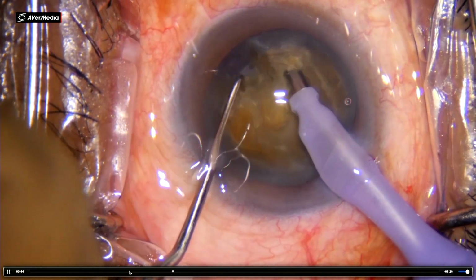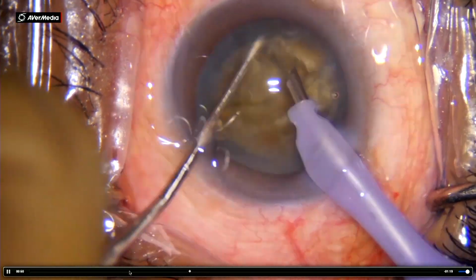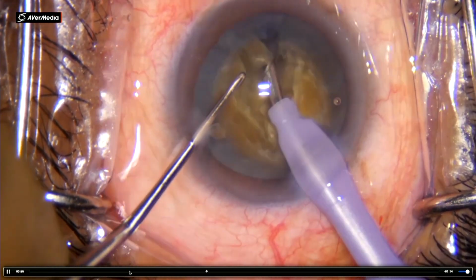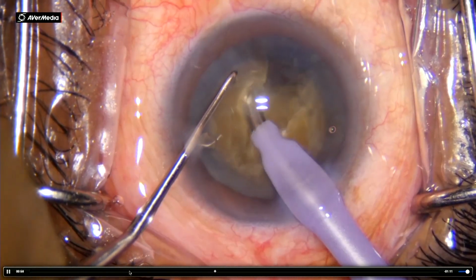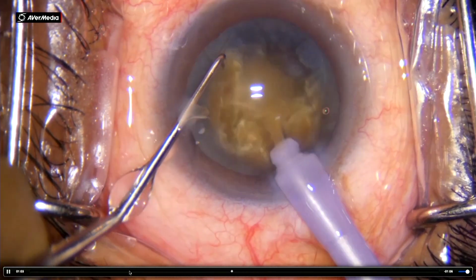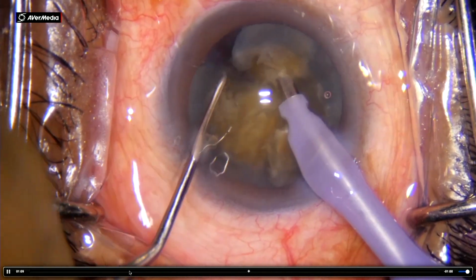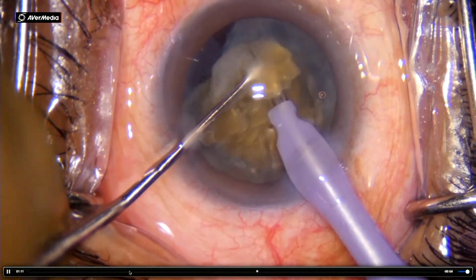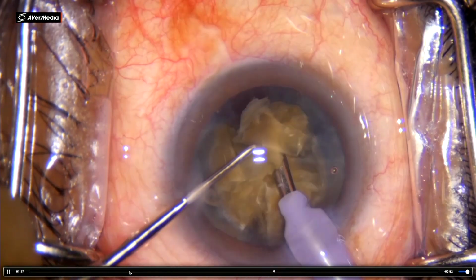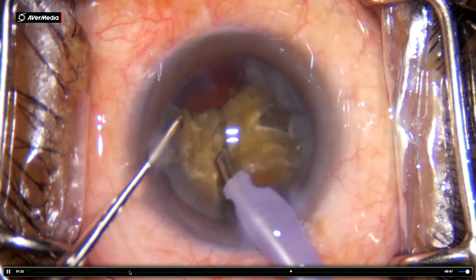So here is the stage when I'm holding the nucleus and splitting the nucleus into pieces. It's in a speeded up version, so it's not done this fast. It's in double speed, just to save time. So once the pieces are separated, we can take it on the go or finish off the chopping process throughout 360 degrees and then go, because settings change. But for me, I nowadays don't change the settings at all. So you can do like that also when you are experienced enough. But initially, it is good to chop first with the settings which we said before, and then move on to the quadrant emulsification settings and come to the emulsification part.